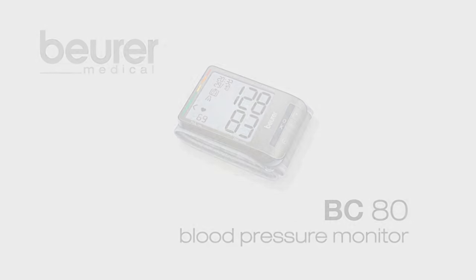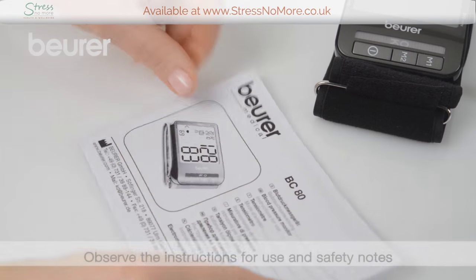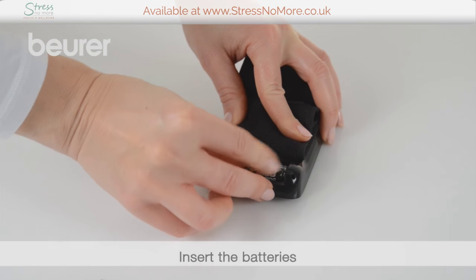Here are some tips for using your BC80 blood pressure monitor from Beurer. Pay attention to the instructions for use and safety notes. Insert the batteries.